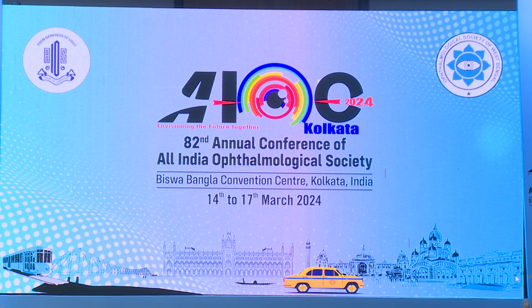Thank you, Dr. Rahul. We really appreciate your presentation because it explains the different kinds of machines. You talked about the Ganzfeld bowl, where you get the flash stimulation. The other is the screen, where you get the stimulation by the screen, and the flashlight for the babies.